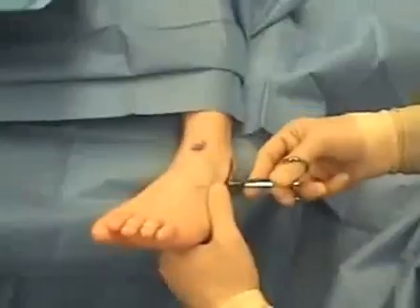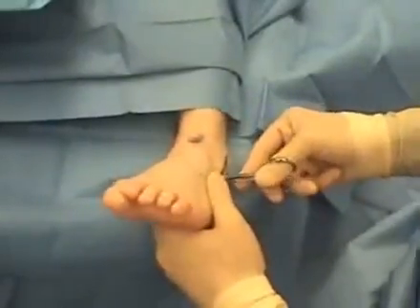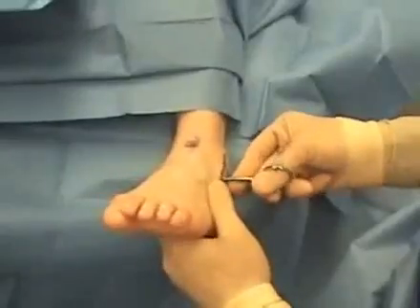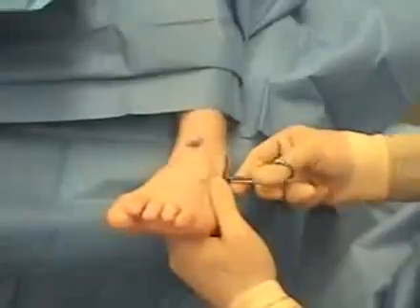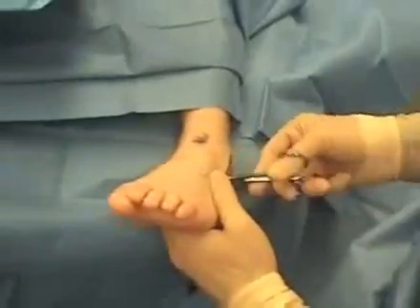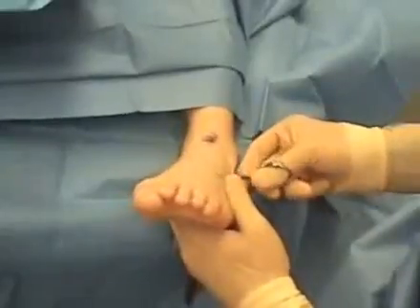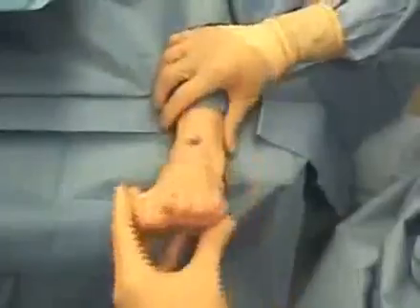Do a little bit of blunt dissection, and we're going to cut those interosseous fibers so that our stent can go into the canalis, and then those fibers will heal back together. It's not a problem. You can feel the tip of the scissors medially with your other hand, so that way you make sure that you've cut those fibers all the way through. If you don't cut them completely, then that can lead to the stent displacing.